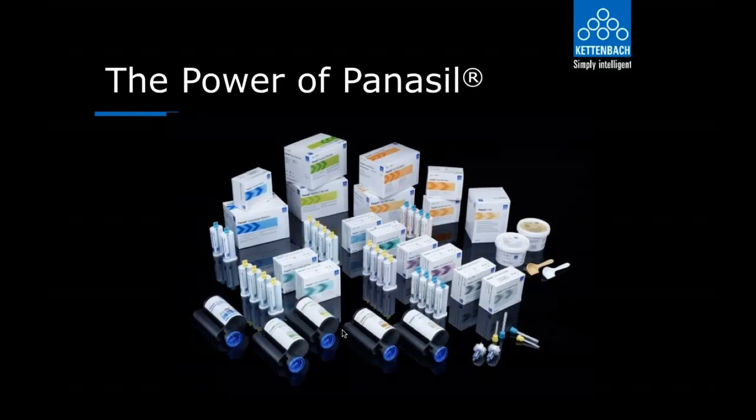So one of the things we want to do is this is the Panasil family that you have available to you. One of the things I want to talk about is when do you use a fast set for crown and bridge, and when do you use a regular set? Fast set being a 2-minute set, a regular set being a 4-minute set. And I will tell you that if you have more than 2 preparations, I would not use a fast set. And the reason for that is because of just the set time. Chances are you're going to get some type of distortion.